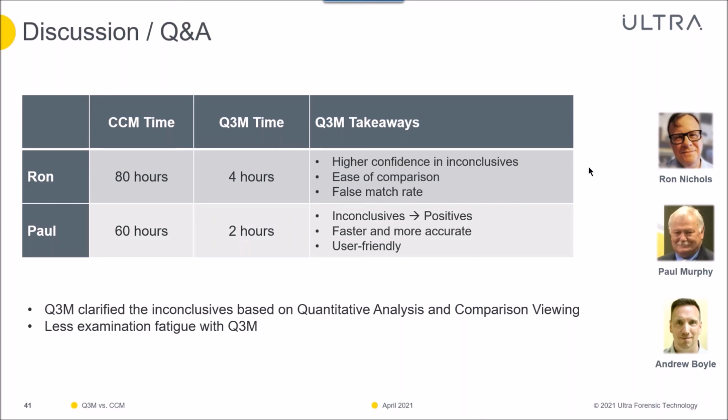Thank you, Ron. I have a question here from Thomas Sismore. I think it's akin to the question about the quantum 3D microscope replacing the conventional microscope, but it's asked differently, it's more about the quantum 3D microscope. Is it likely to replace the match point, like the IBIS match point at all? This is a confusing question, Thomas.